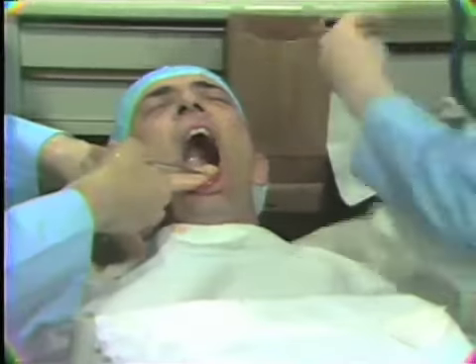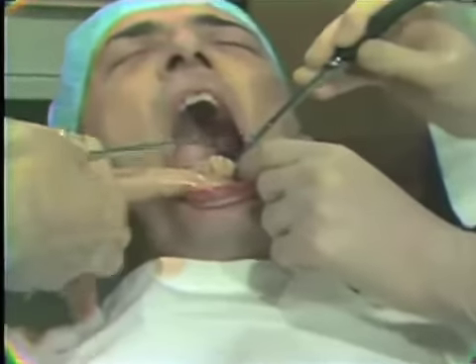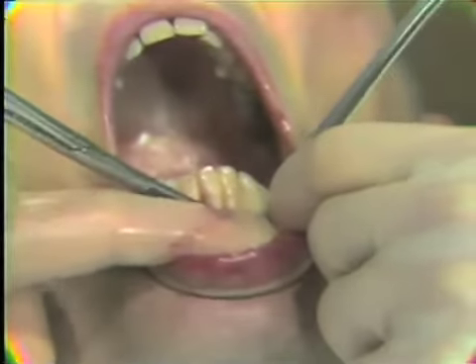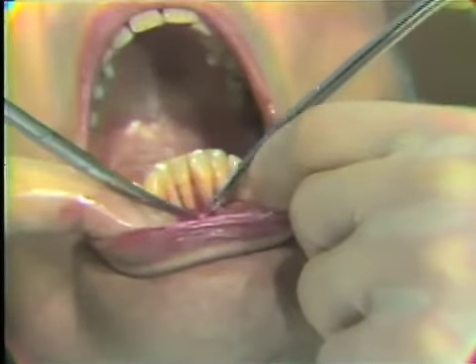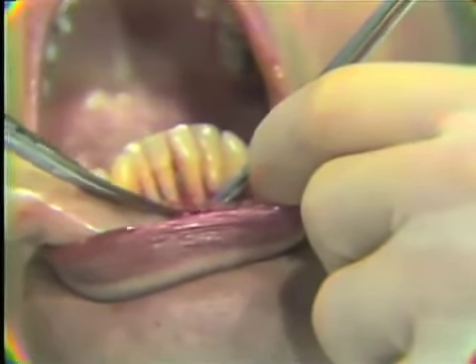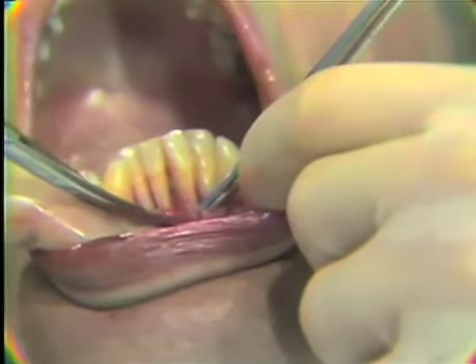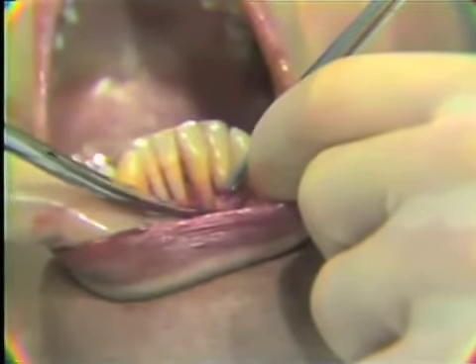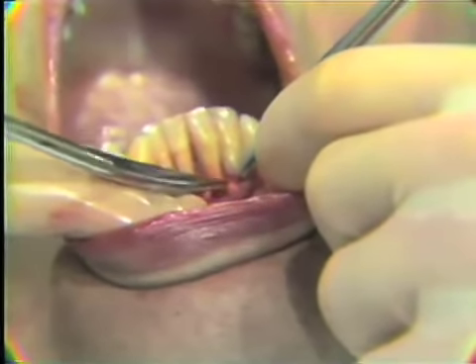Retract that with your aspirator, Rennie. As regards the tags that we find underneath the flap, there are times when, again, it's hard to distinguish where these are attached. And with the use of the aspirator, the assistant can pick up these tags. It again permits me to visualize the attachment of the tag and excise it or remove it with the suture scissors.